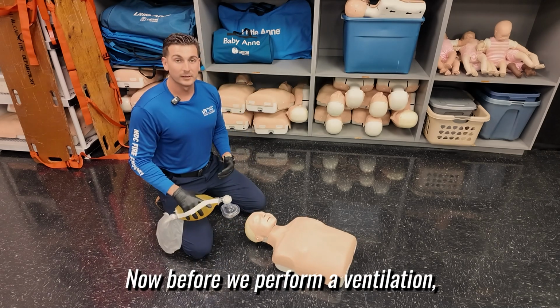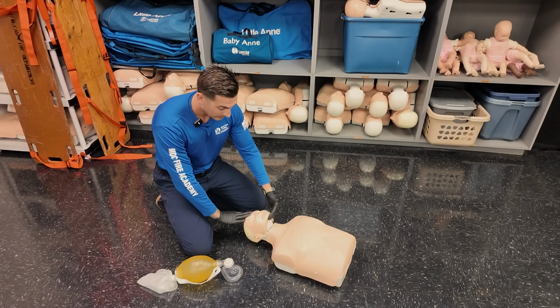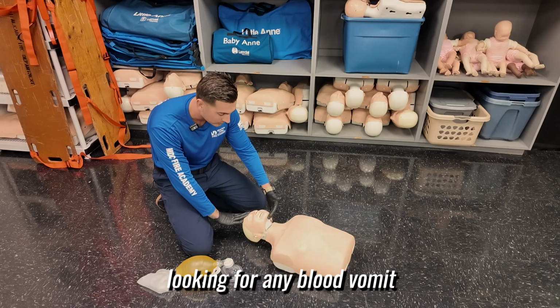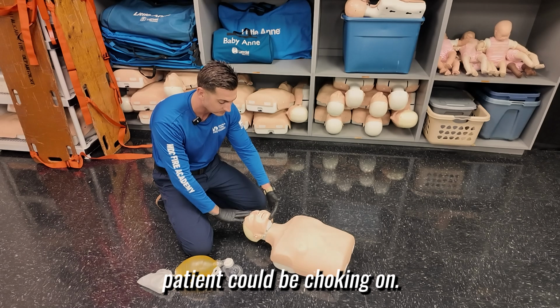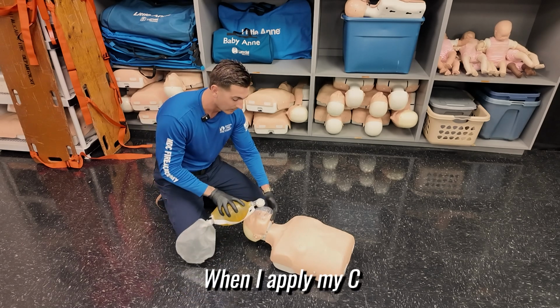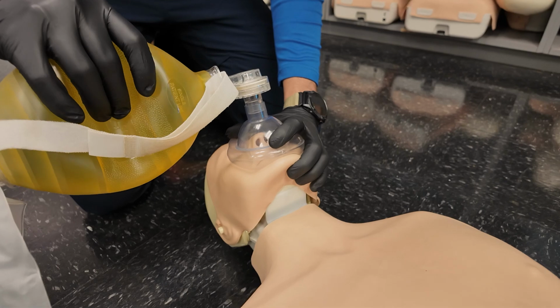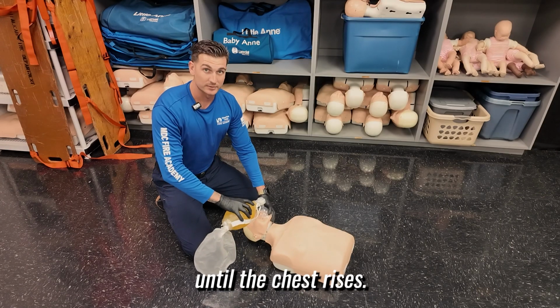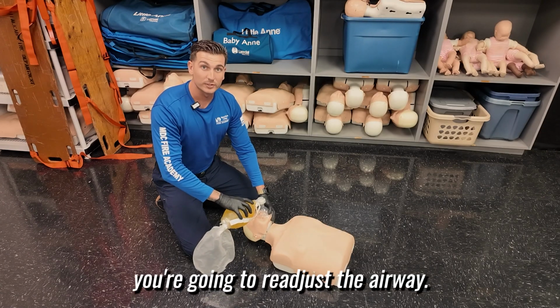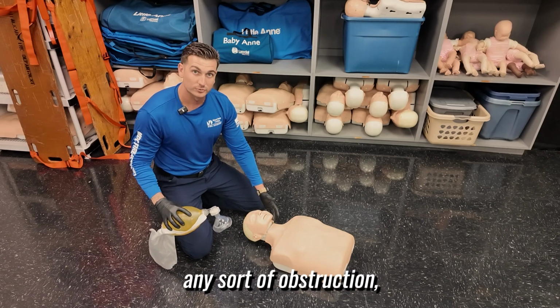Now before you perform a ventilation, let's say we're using the head tilt chin lift method, you want to visualize inside that airway looking for any blood, vomit, or anything that the patient could be choking on. When I apply my CE method, I'm going to go ahead and give 1 rescue breath. You're going to be squeezing the bag only until the chest rises. If you have resistance, you're going to readjust the airway and visualize inside the airway again to see if there's any sort of obstruction.